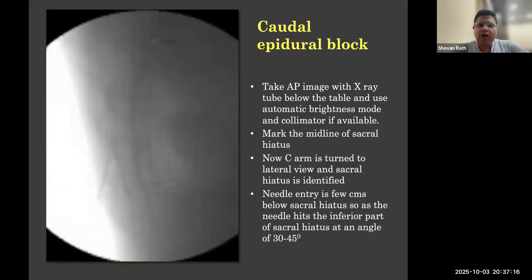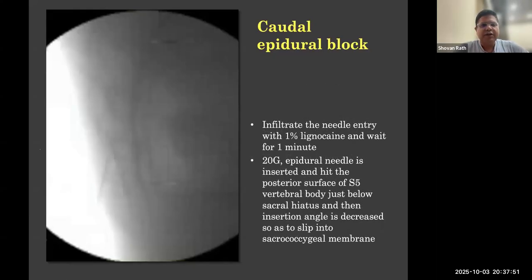Caudal epidural can be done under ultrasound also. What I do normally is put the needle under ultrasound, which is okay. But after that, many times we have seen the dye distribution going into the small vessels, because it's a bony structure and there are a lot of vessels inside. Many times after putting the needle, the drug goes into the vessels. In that case, hazardous complications will be seen. So to avoid that, you can put the needle through ultrasound also. This is very easy. And after that, just put dye and make a confirmation.